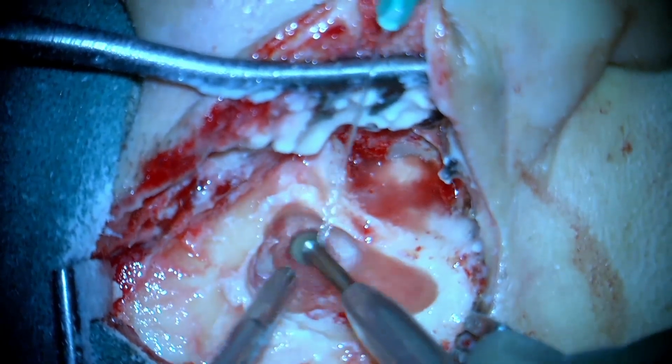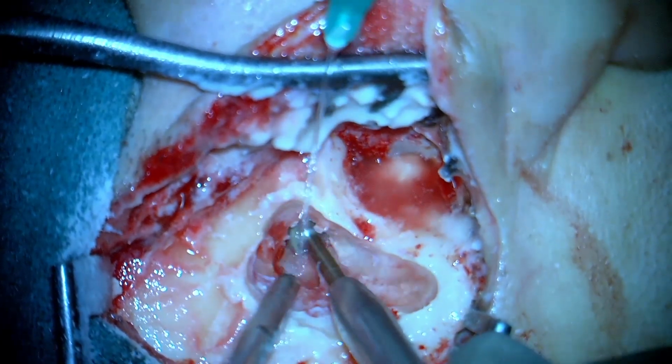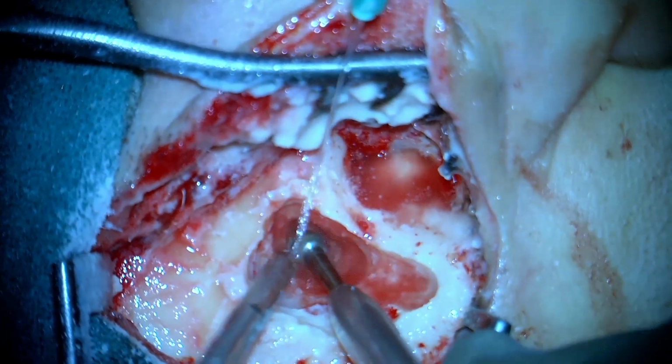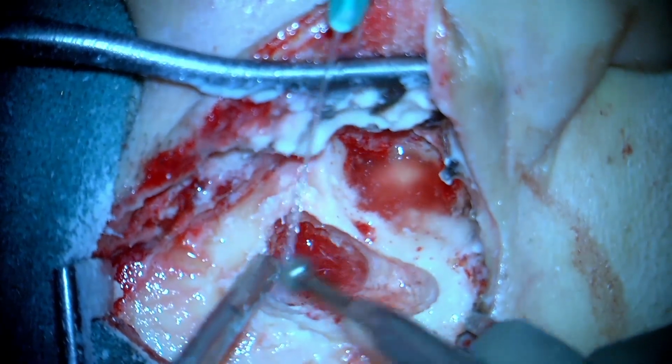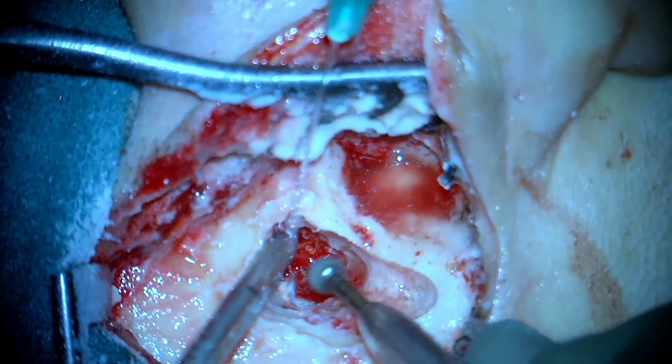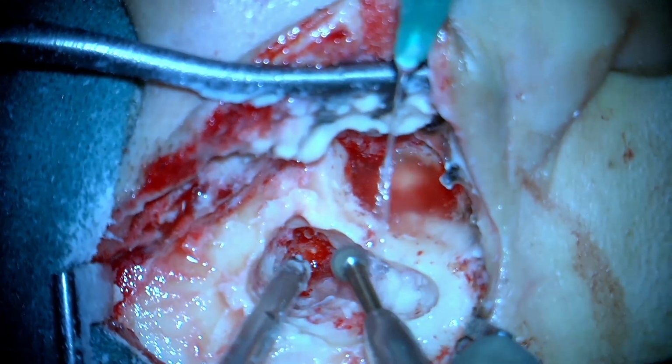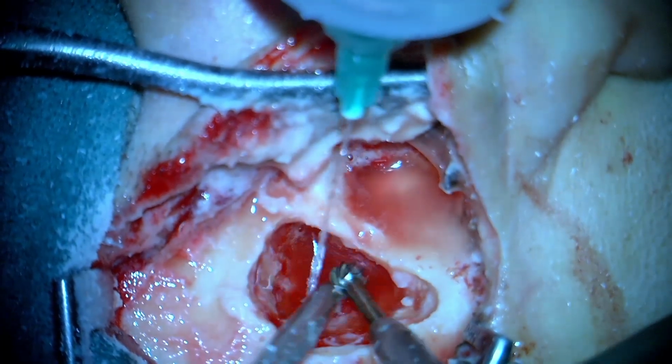So you see, these are the standard steps of cortical mastoidectomy. We'll keep lowering the drill size as we go deeper inside the mastoid cavity and towards the antrum. One must be careful regarding the presence of the sigmoid sinus. Sometimes it is anteriorly positioned, may significantly hamper the approach, and must not be injured.